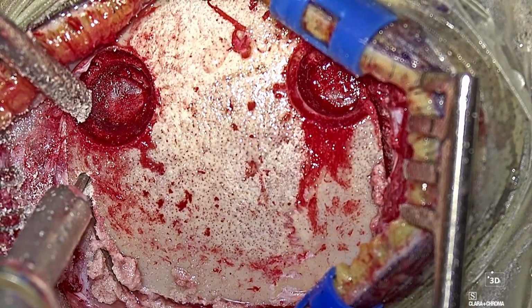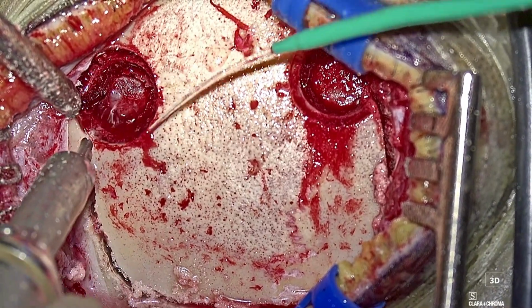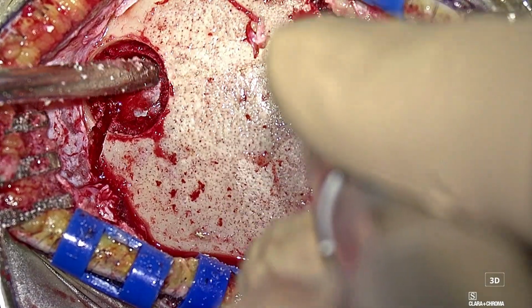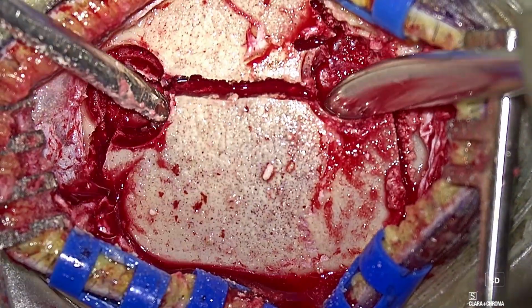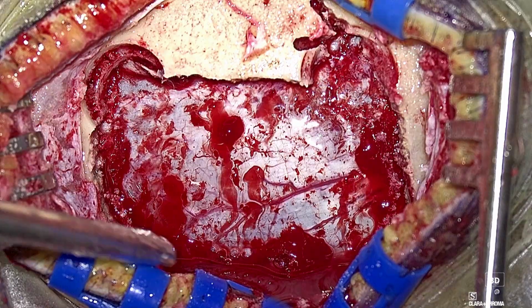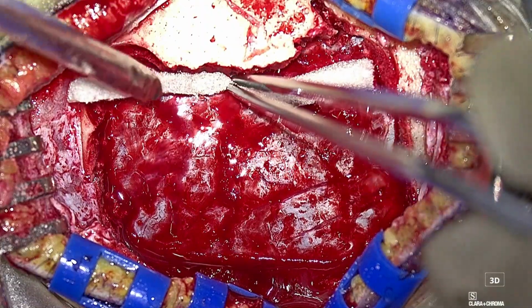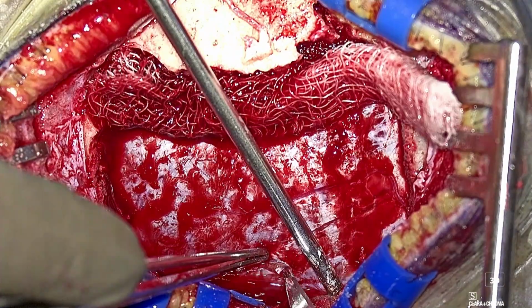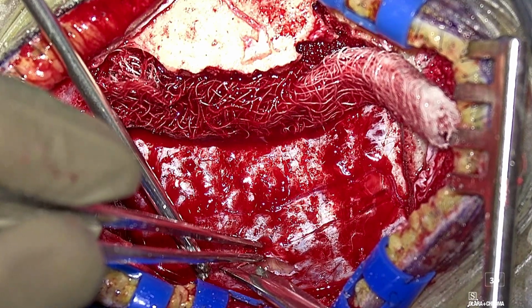The patient was placed in a supine lateral position and a linear incision was marked over the mid parasagittal area. With the help of two burrs, a left parasagittal craniotomy was performed. The bone flap was then carefully elevated. Bone was nibbled in the midline to expose the sinus adequately, which was separated and safeguarded. A U-shaped durotomy was performed and reflected over the superior sagittal sinus.